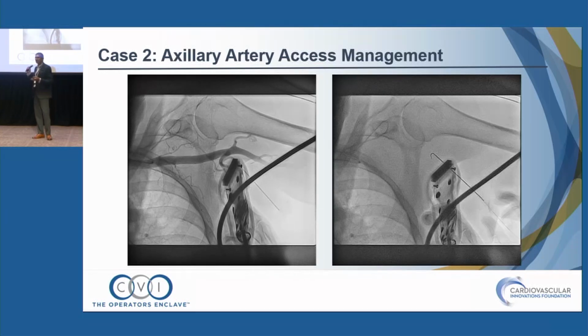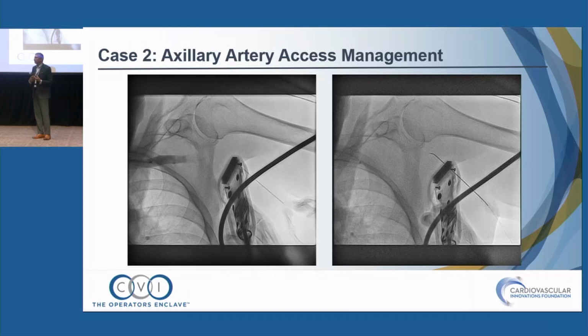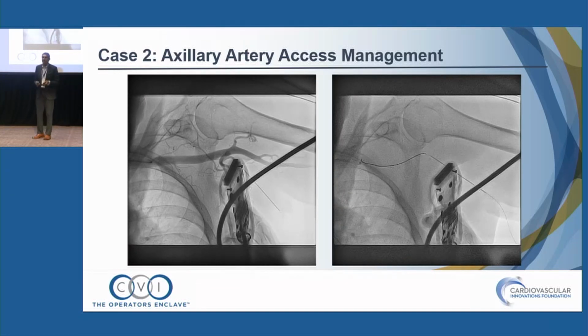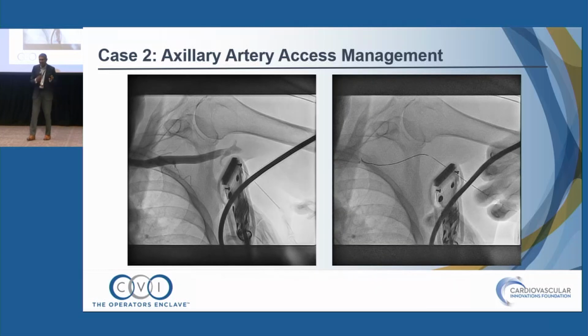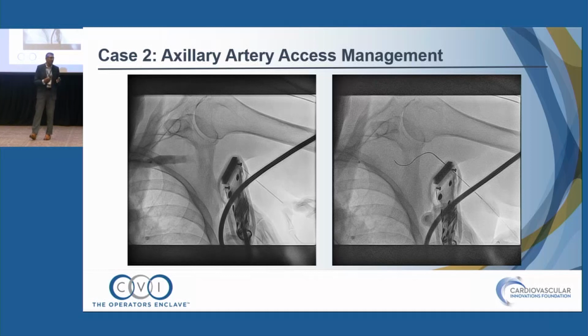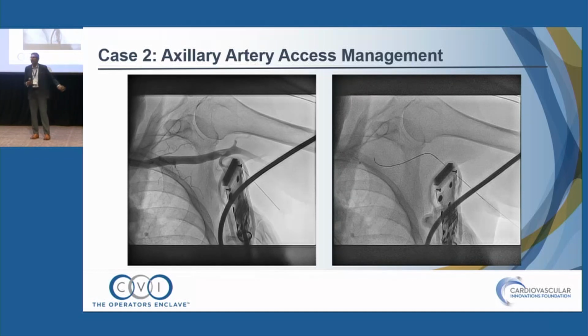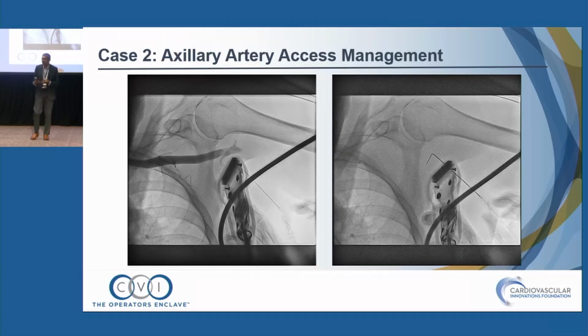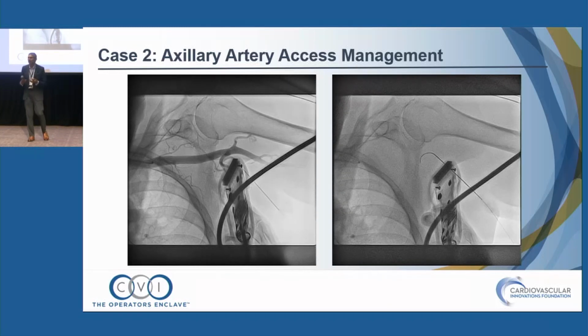Because as you can see, our sticks as an interventionalist are far more lateral. And that has got its own real problems. Of course, it can be slightly easily compressible, but the challenge is that you can actually hurt the nerves if your arm remains extended over a long period of time. And I think getting a surgical conduit in many situations can be the right approach.